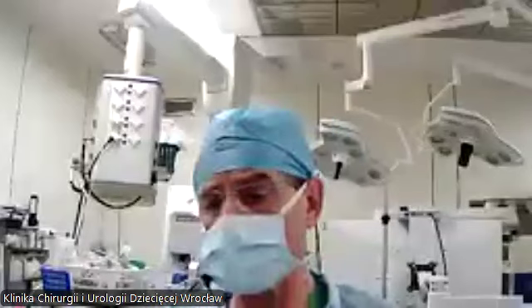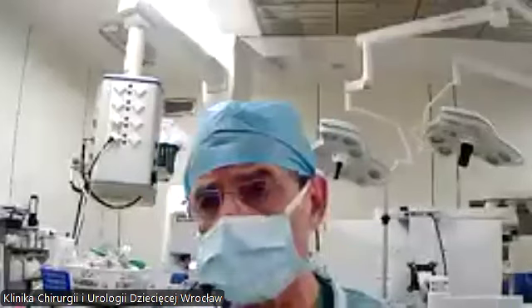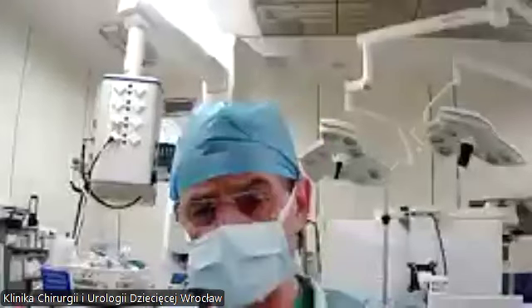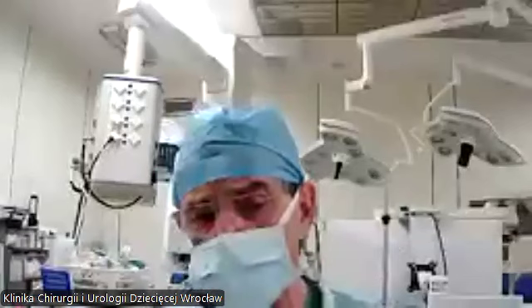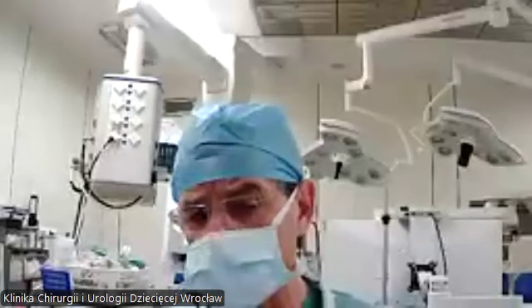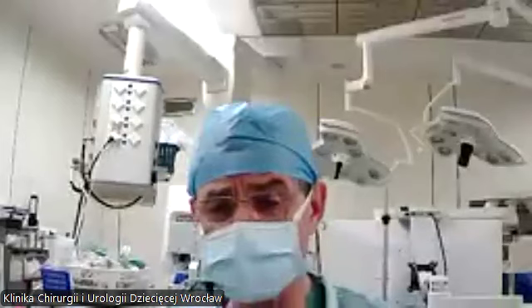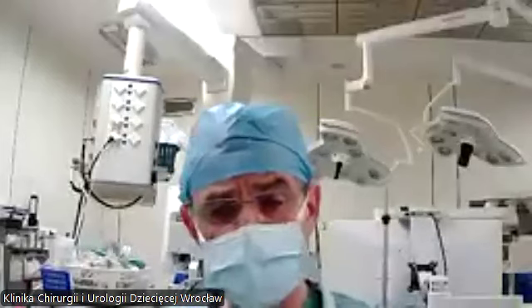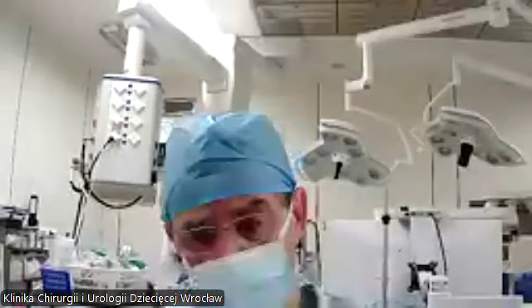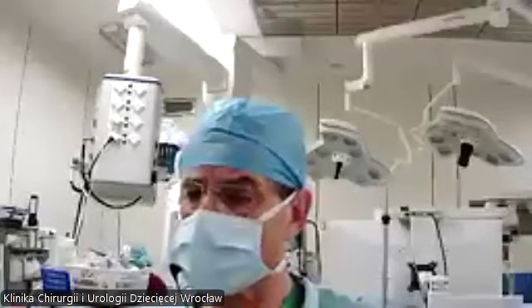I presented a very special case that we operated on 2 years ago that had a right lung agenesis. So there was only one lung, the left lung, and we did a thoracoscopy through the left pleural cavity. The baby was ventilated with only one lung, the pleural cavity was insufflated, and the baby was doing fine for the whole procedure. So it is possible to do it. I think that I answered all your questions.